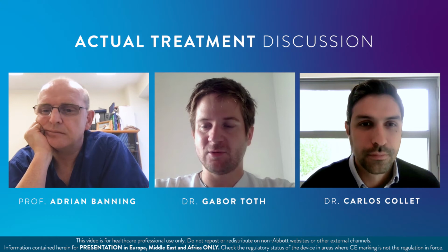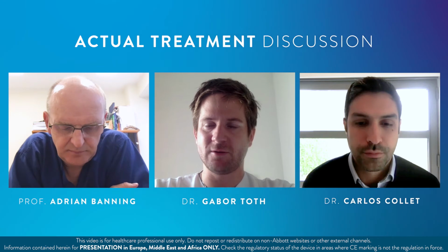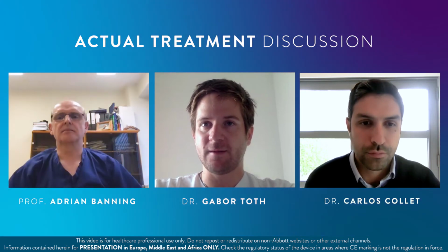I think the most important thing here is to avoid adding multiple layers to that. So I think the approach with the balloon and drug-eluting balloon is a really good choice. Of course, you have to see whether after lesion preparation you have a good enough result to go on with drug-eluting balloon. But as long as the lesion preparation allows you, with its result, to go for drug-eluting balloon, I think limiting the layer of metals is a very good choice.